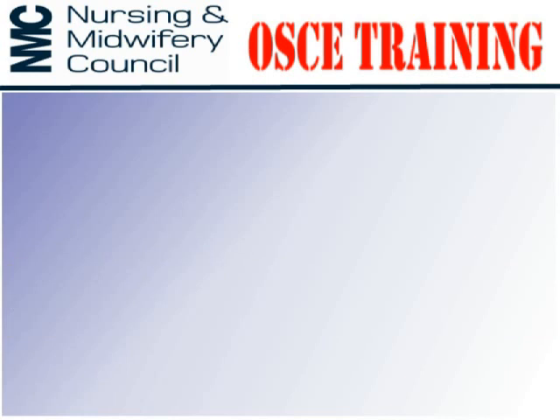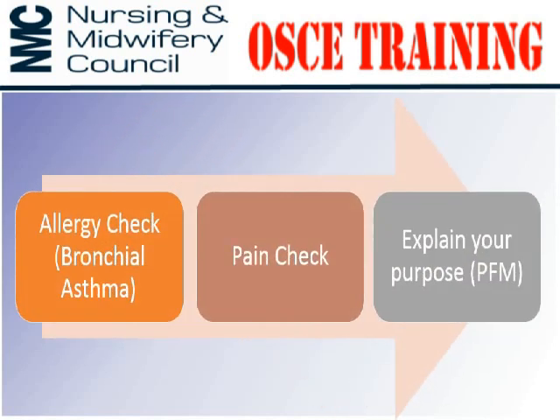Next, you will have to check for allergies. The patient will be having bronchial asthma and they will have allergy to something like dust or pollen. You also need to check the allergy band on the patient arm. Then you need to check the patient for any pain, and if they are complaining of any pain, you need to score that using the pain assessment tool.